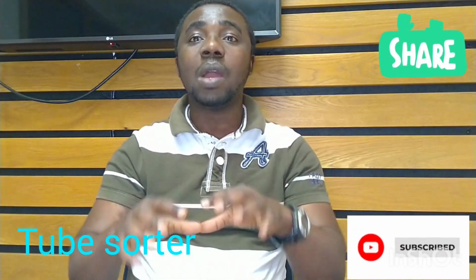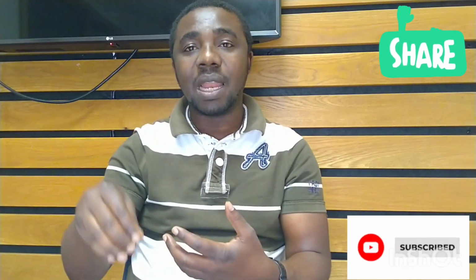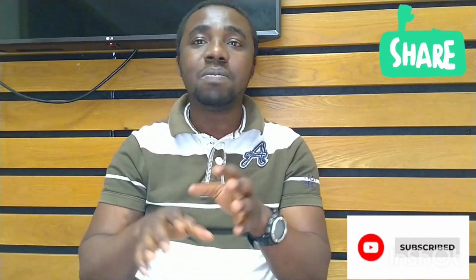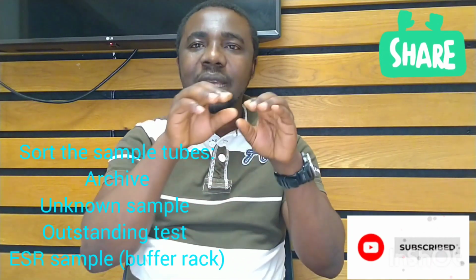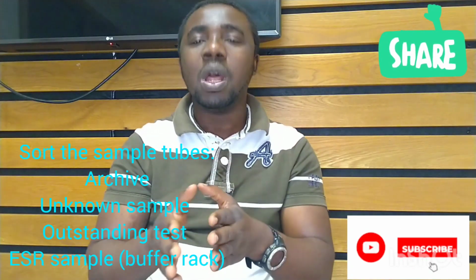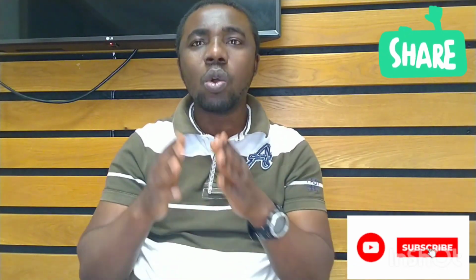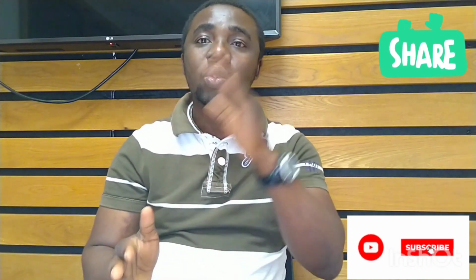The tube sorter again would then scan the barcode of each of the samples on that rack. That is what we call maybe TS 500 and so on, but it generally is called the tube sorter. So that tube sorter would then sort the samples, sorting in the sense of: has it finished, is anything still outstanding, is there anything that is unknown. And anything that has completed, it will just archive it. When we talk about archive, it basically means that everything has been completed, everything is fine.